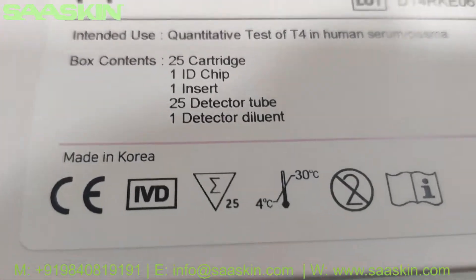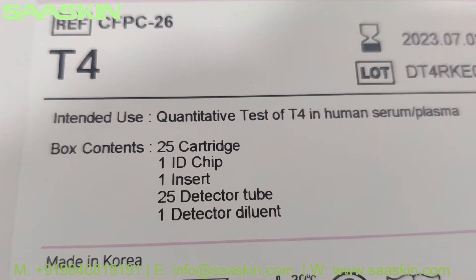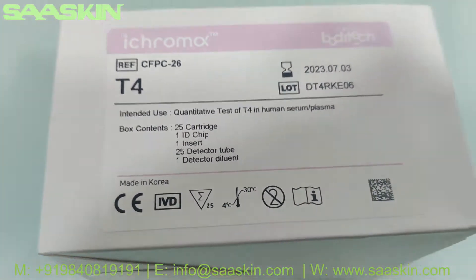Each box contains 25 cartridges, one ID chip, one insert, 25 detector tubes, and one detector dilution buffer.